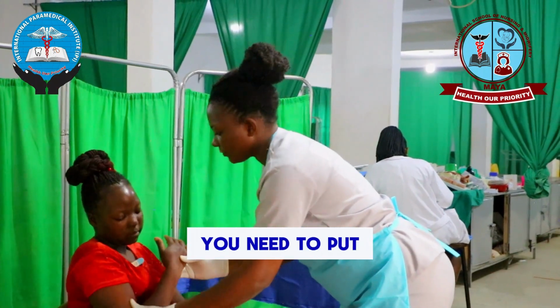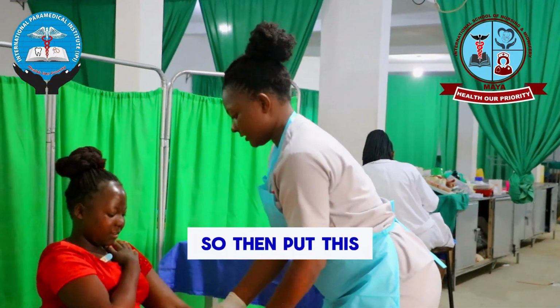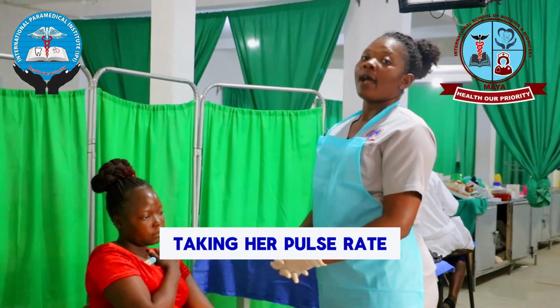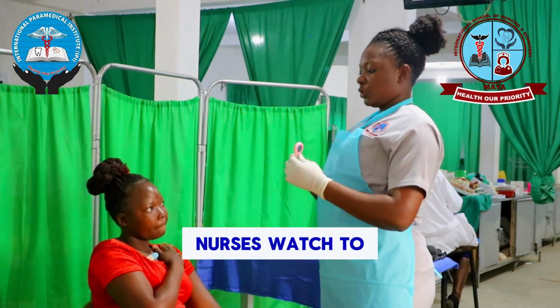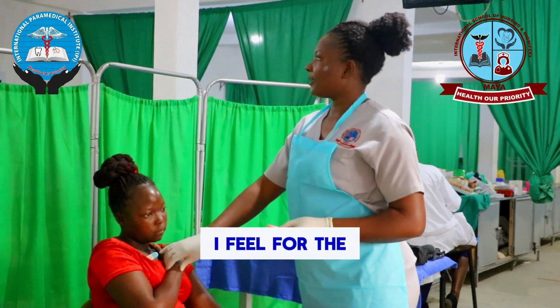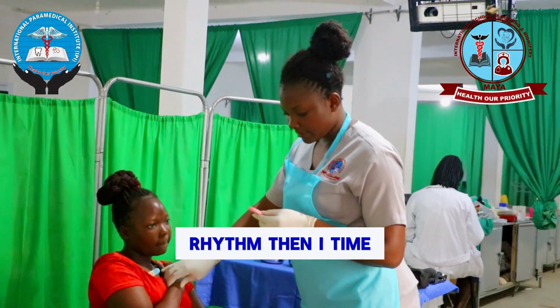So, Madam Esther, you're going to put your hand like this. Don't worry, it's not painful. So you can put this hand here. So as I'm taking Madam Esther's temperature as well, I'm going to be taking her pulse rate. So I'm using the nurse's watch to count the beats of her heart. I feel for the radial artery. I first confirm its rhythm, then I time.